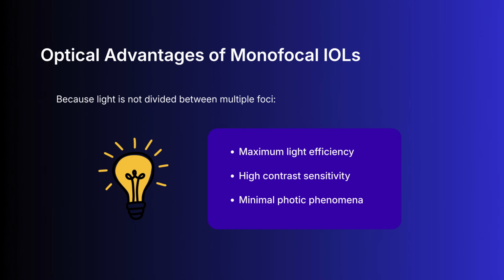Because the light is not divided between multiple focal points, almost all the incoming light energy contributes to forming the same retinal image, and this results in 3 important optical advantages: maximum light efficiency, highest contrast sensitivity, and very minimal photic phenomena such as glare and halos.